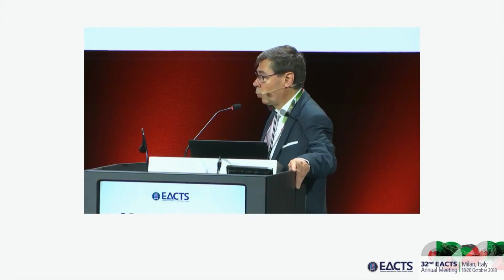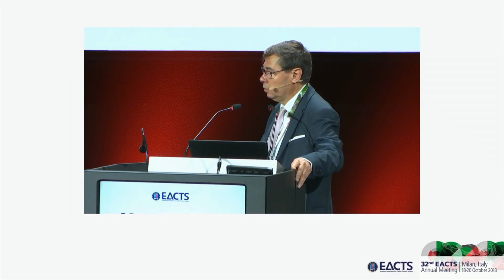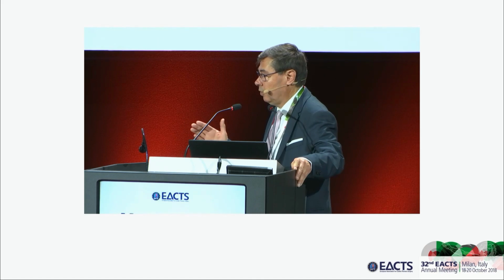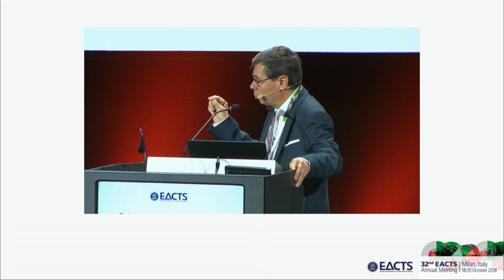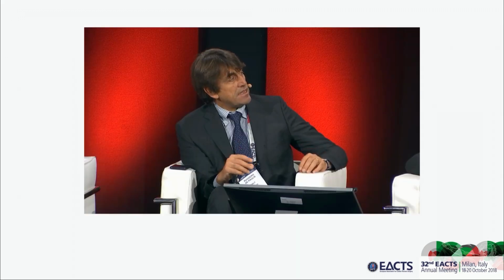Yes, sometimes we had cases where, because the coaptation length was not long enough, we went back on pump. Sometimes we have a billowing of the valve without any aortic insufficiency, and we see that the effective height is too low, then we go back on pump in order to heighten this coaptation by adding a small plication at the free margin, even if there is no AI. So billowing per se is the indication to increase the level of coaptation more?